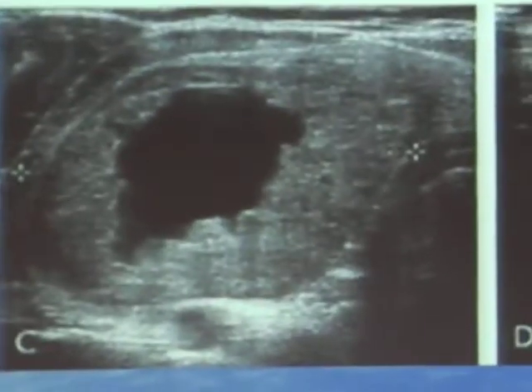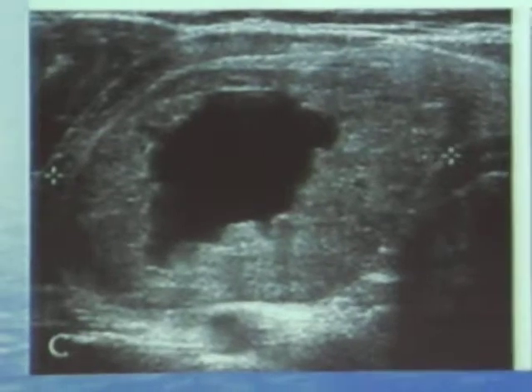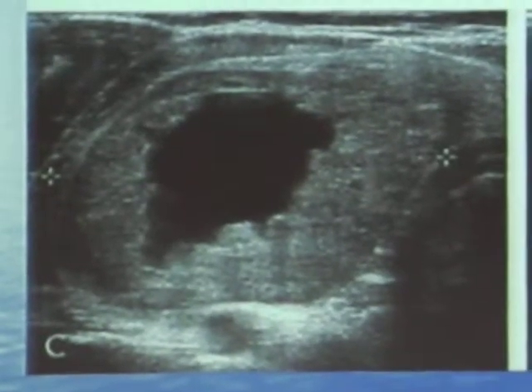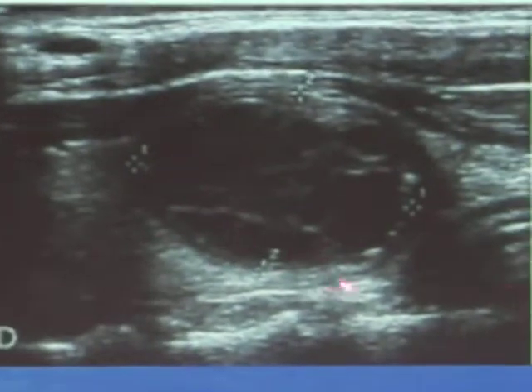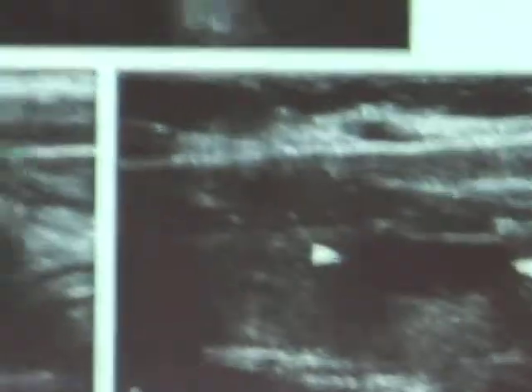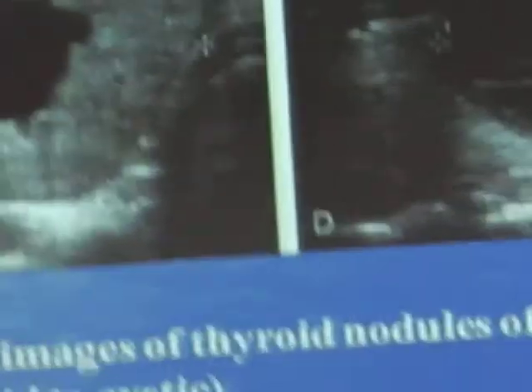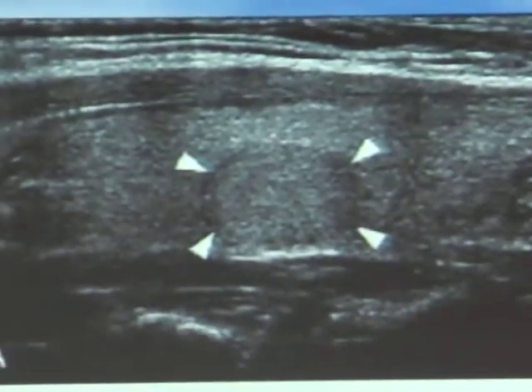Classical, this one I showed you all just now. Hemorrhagic transformation maybe, yeah? Irregular cystic area. This is like a nodule which has cystic spaces inside. Maybe a cyst. Okay. Bottom line is that this is papillary CA. So we cannot tell. So in other words, we need to put a needle inside.